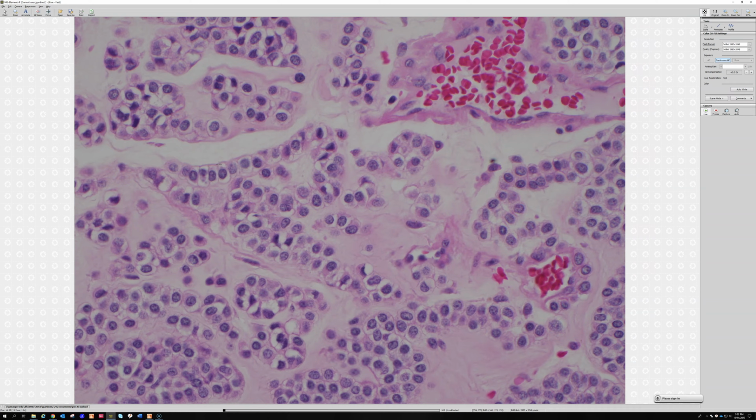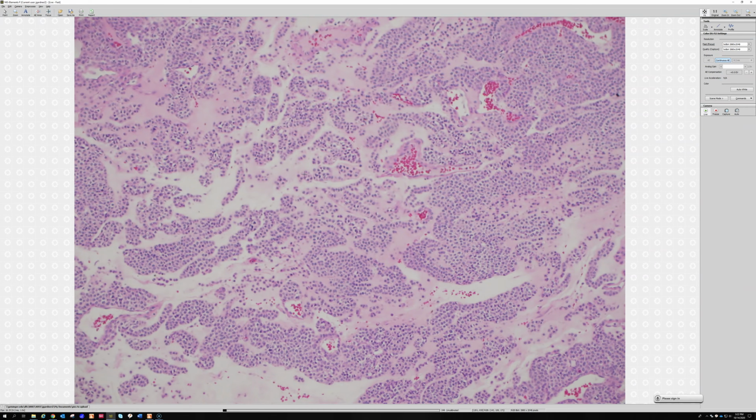Another tumor that does that is epithelioid schwannoma. You can see individual cells wrapped with basement membrane. I don't know if that's really important. It's very pretty though, just so you know. So in any case, that's a kind of a cool and unique feature of glomus tumor. So very nice. These are just such fascinating tumors. And one other little trick that Dr.